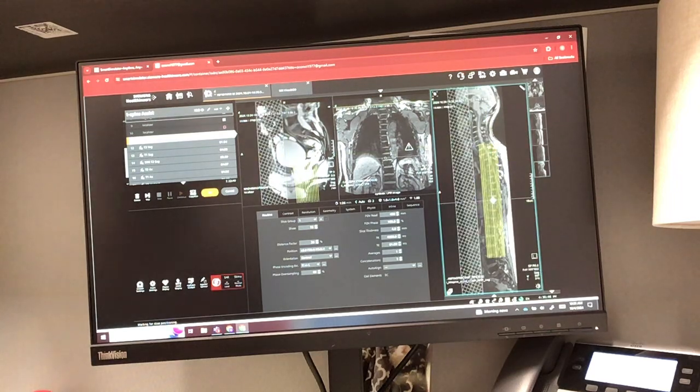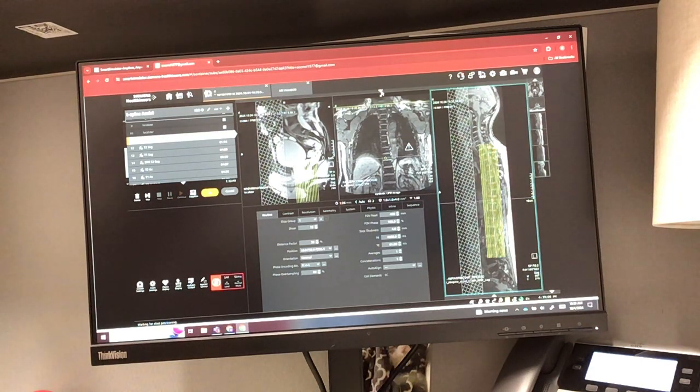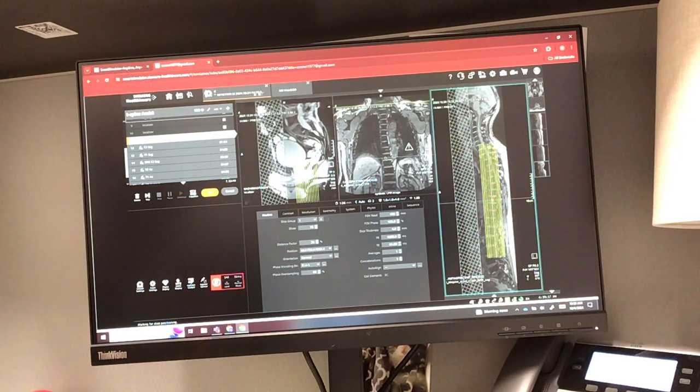So if you look at your sheet, the first thing it wants you to do is that T2 coronal localizer, which is also what pops up right there. We're looking to see if there's any curvature in your patient's spine. Is there any curvature, any scoliosis that's going on? So a lot of times that's what you'll run a coronal localizer for when you're doing spine imaging.